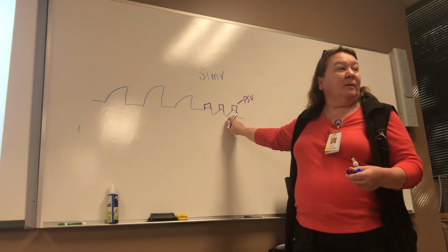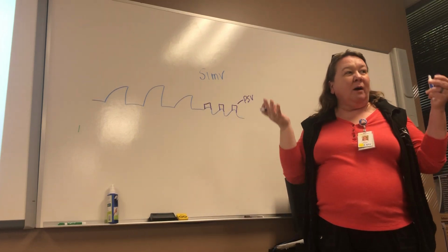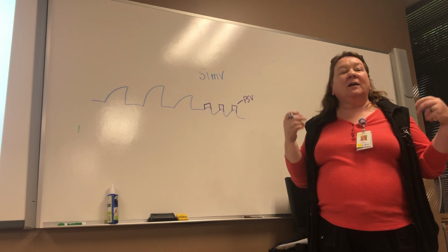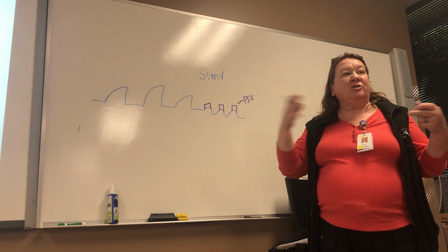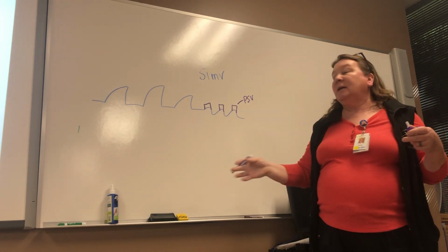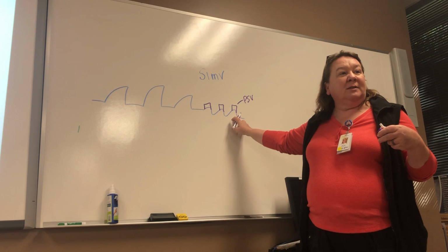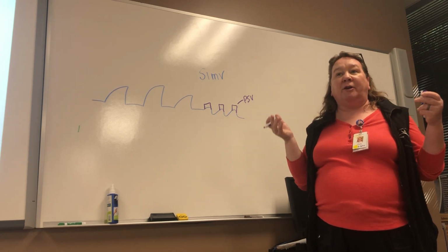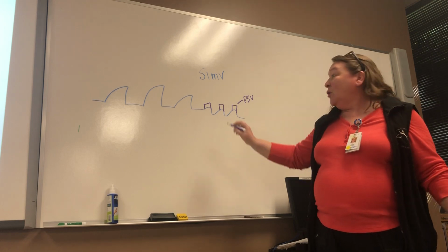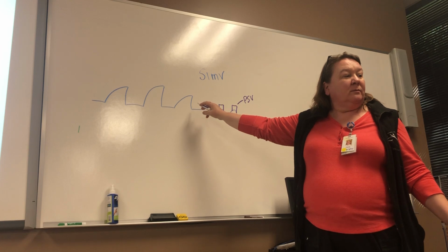If your tidal volume is too low on the spontaneous breaths in SIMV, then pressure support will help bring the volume up. Think of it just like BiPAP. In BiPAP, we have our IPAP and EPAP and pressure support to help increase tidal volume. Pressure support on SIMV basically is doing the same thing. It's adding pressure to the patient's spontaneous breath to help bring their tidal volume up. It's only used on the spontaneous breaths, never on the mandatory breaths.